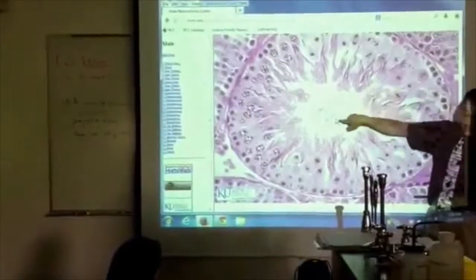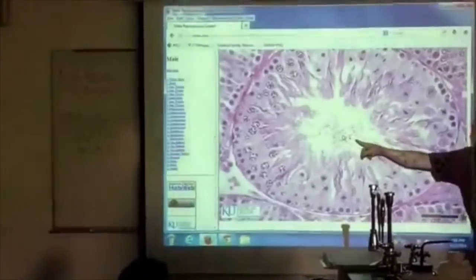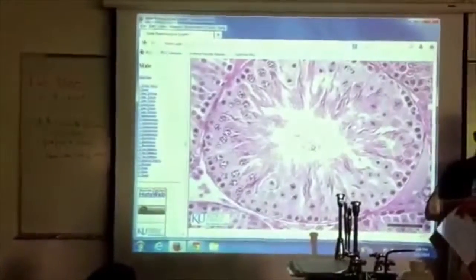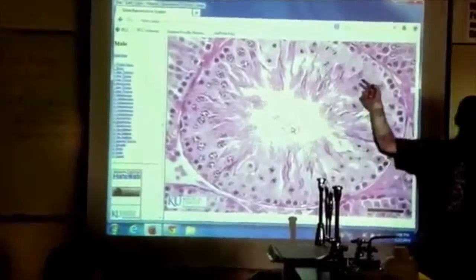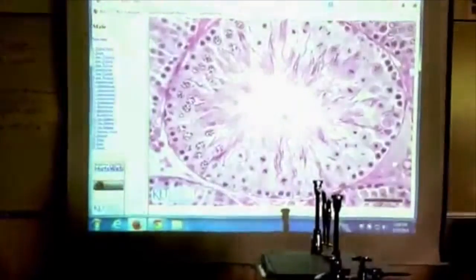When you're in the center in a testis, those are sperm what? Spermatids. Because they're immature, they become sperm formally at the epididymis. So next week, you can't just say sperm. You've got to say spermatogonia, spermatocyte, spermatid, or sperm, depending on what we're talking about. That's the level of detail there. But otherwise, you kind of know this, right? The fun begins when we do the girl part.